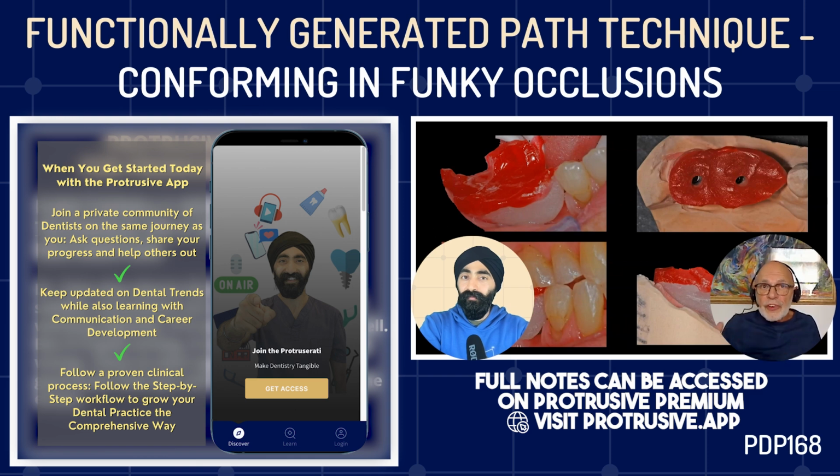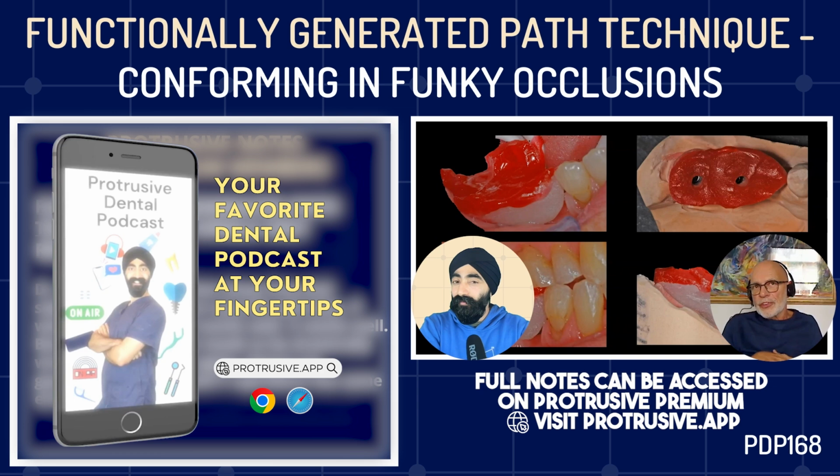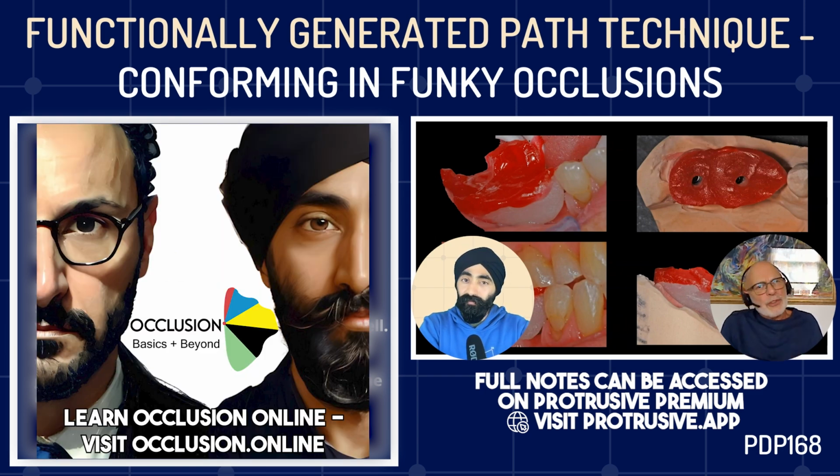And I think that those free end saddles can sometimes be very hit and miss if you're working digitally. I mean, if it works well, it works well, but if it goes wrong, it tends to be drastically wrong, and you have to start again. And there's no guarantee that you won't reproduce the same errors. Whereas this technique that I'm advocating is pretty foolproof. I mean, it gives you something which really doesn't need much adjustment at all.